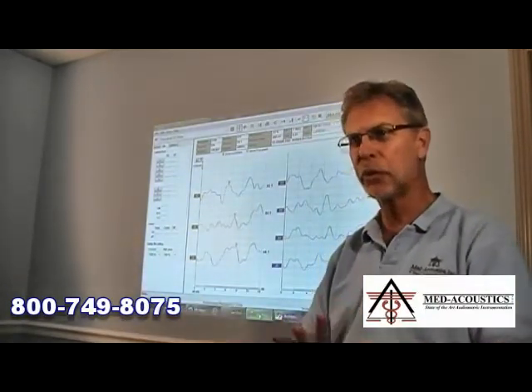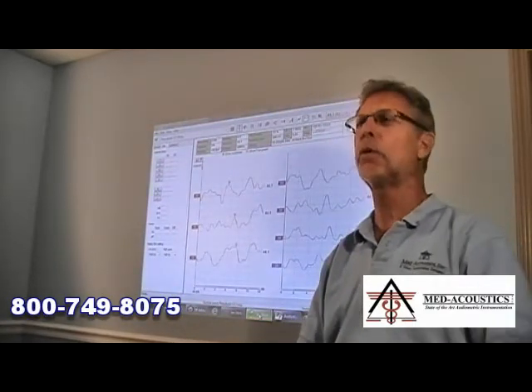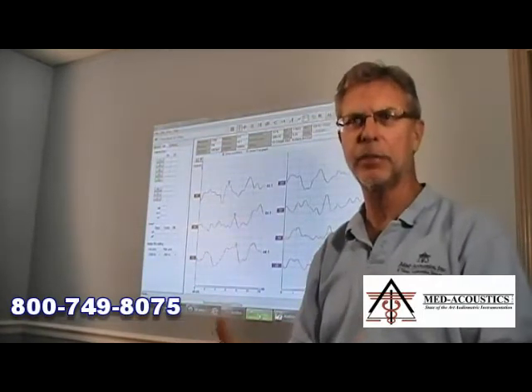And once I made sure that I didn't have any problems in the way that the equipment was installed, I asked the audiologist, do you have a radio station nearby? So she opened the curtain of a window, and there was a nice big AM transmitter, just a stone's throw away. And so I said, well, this won't run in here. It absolutely positively won't run in this environment.